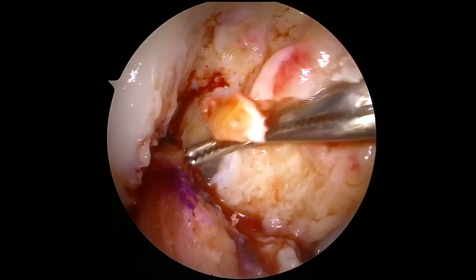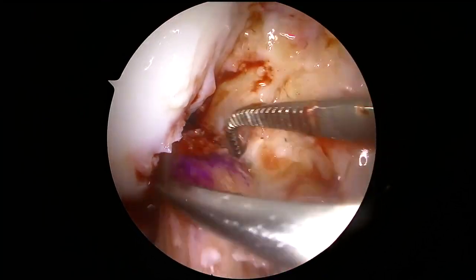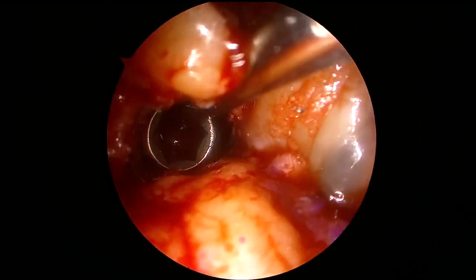The ACL graft is secured first by being passed up the tibial tunnel and pulled into position in the femur. A 7 by 20 millimeter titanium screw is used to fixate the graft in the ACL femoral tunnel.